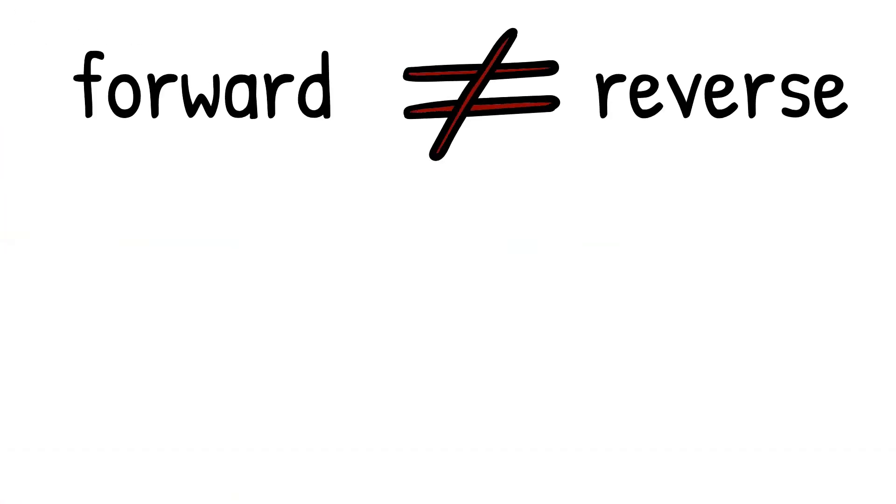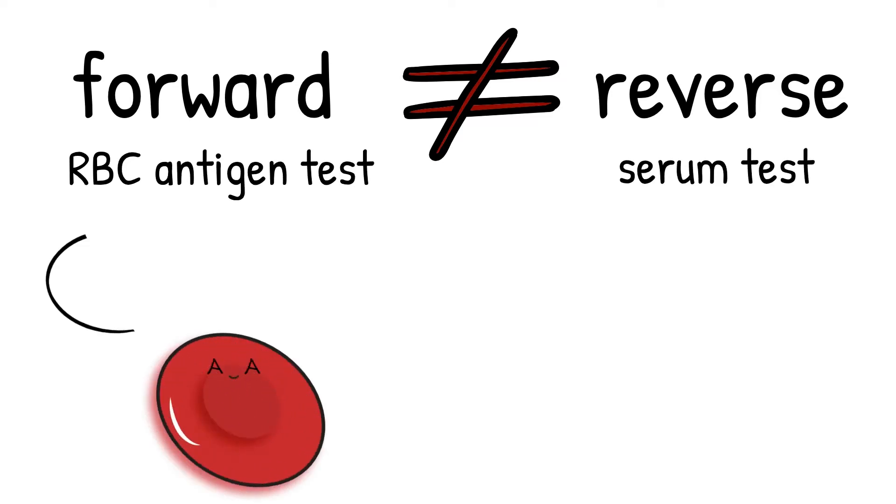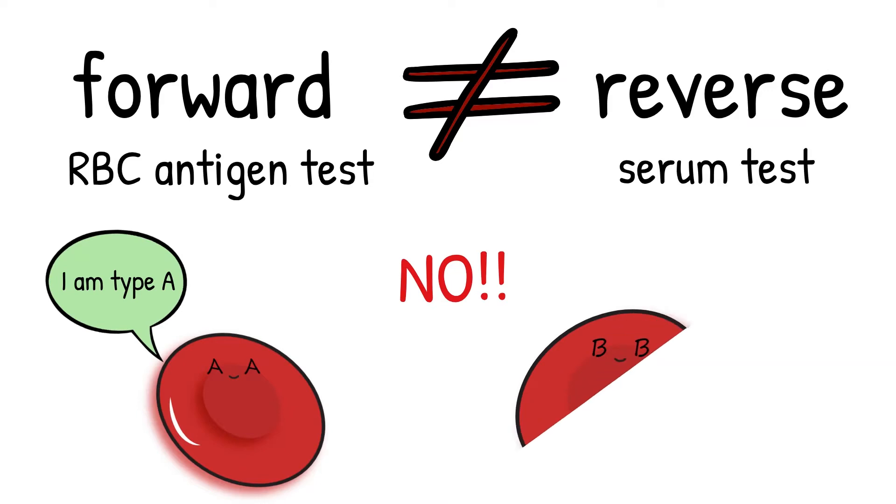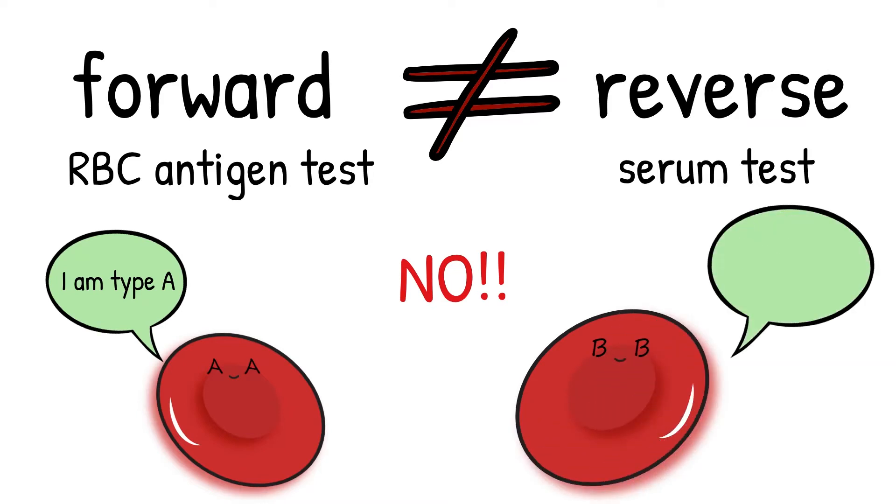A discrepancy exists when the results of a red blood cell test and the serum test do not agree with each other. This can cause from either unexpected positive or unexpected negative. One thing to not overlook when approaching ABO discrepancy is technical error.